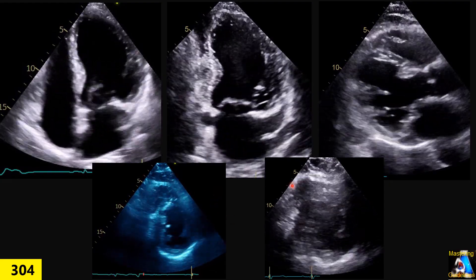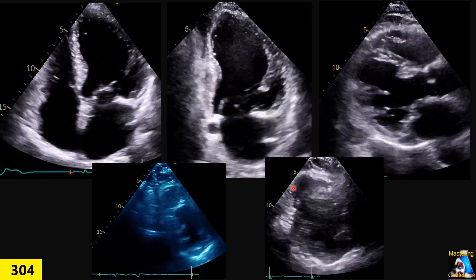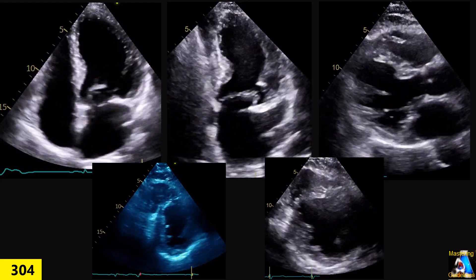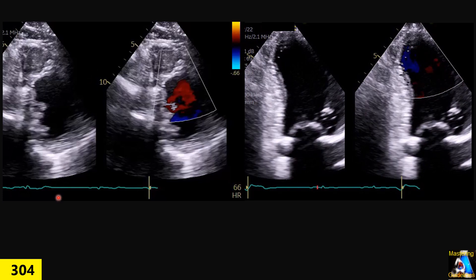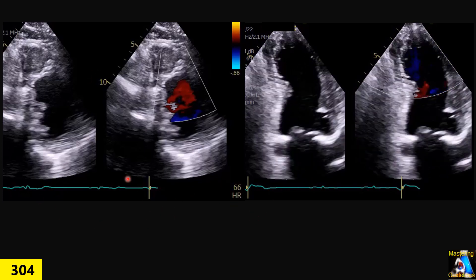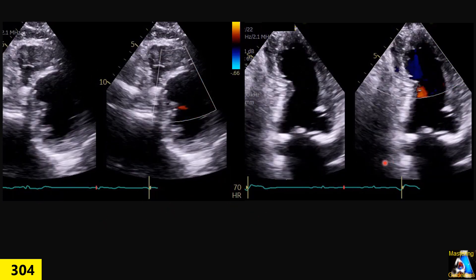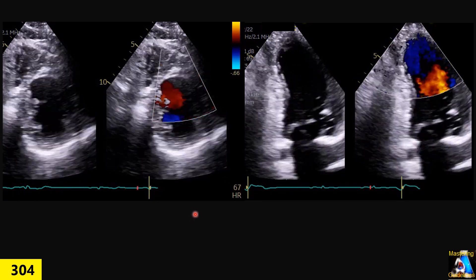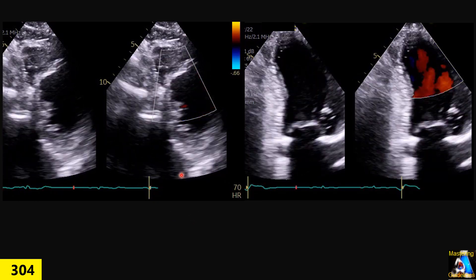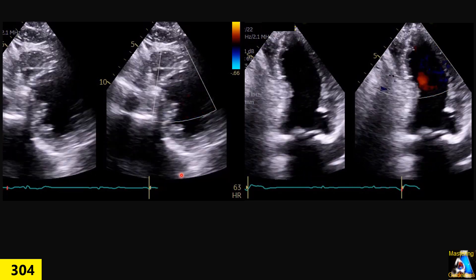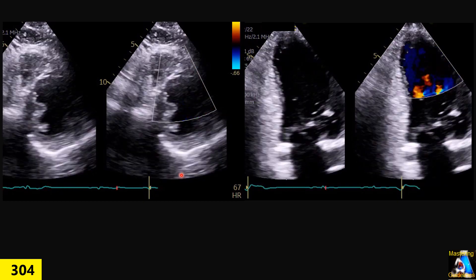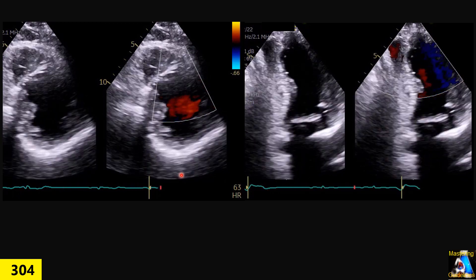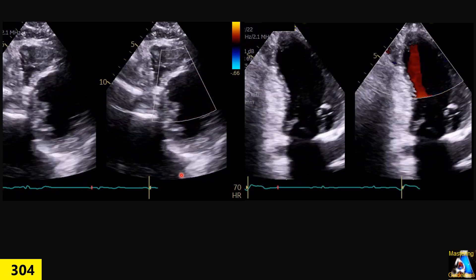Is it coronary artery disease or not? Now, if we add these two additional clips to the previous ones, do you still think the patient has cardiomyopathy or is there another reason? The patient did not have any risk factors or any genetic family history of any disorder.